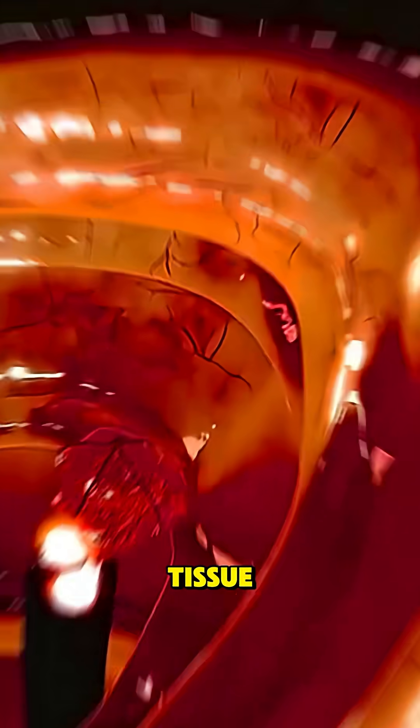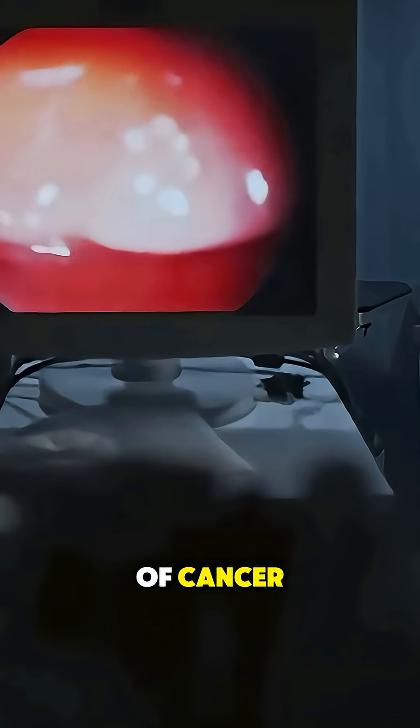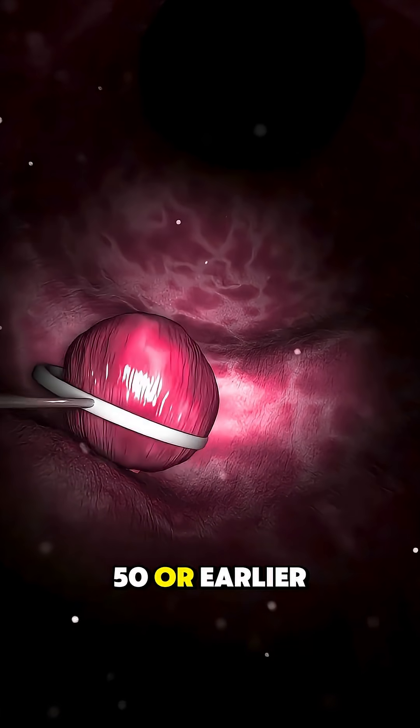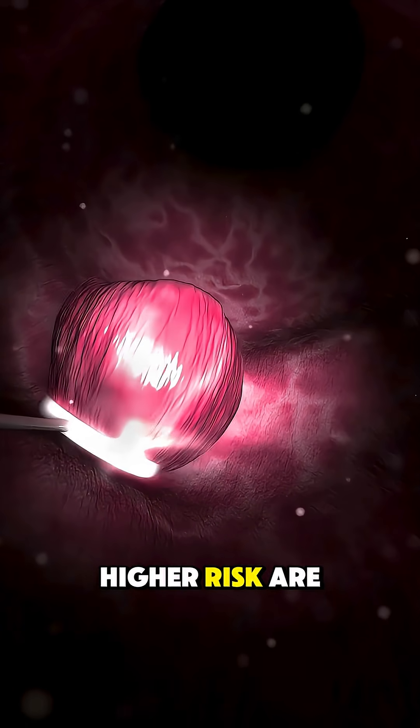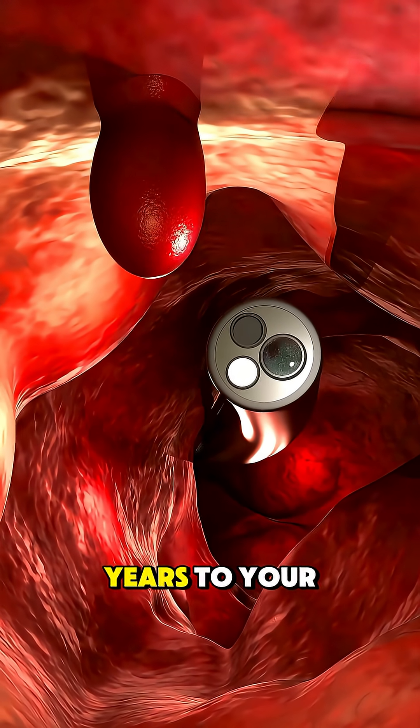Besides removing dangerous tissue, polypectomy allows doctors to examine it for early signs of cancer. That's why routine screenings after age 50 — or earlier if you're at higher risk — are crucial. A few minutes in the procedure room could add years to your life.